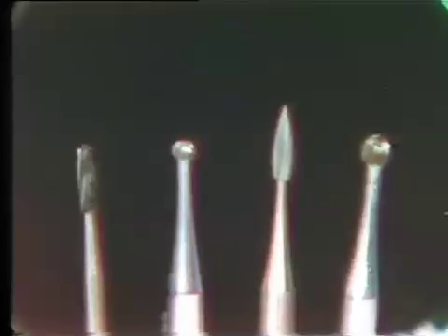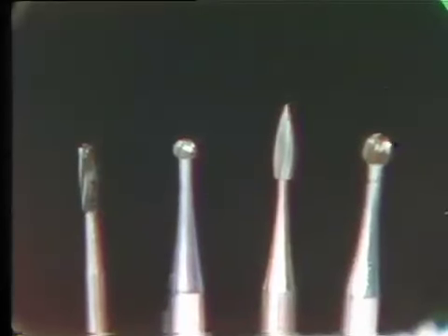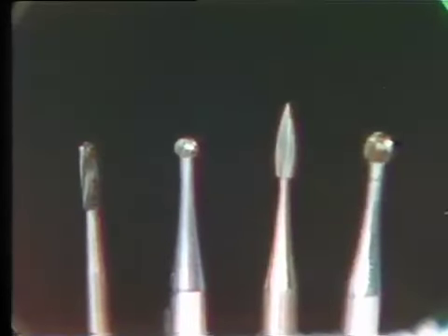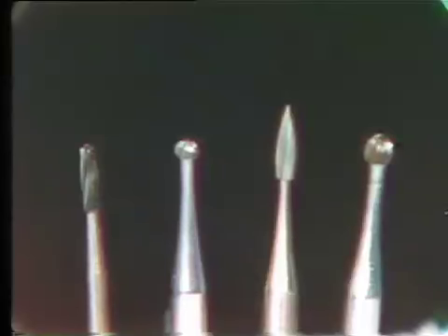The next burr is the number 4 round burr. With this burr, we go directly to the pulp and use this burr to unroof the pulp chamber in all anterior and bicuspid teeth. The next burr over is the surgical length flame-shaped burr. This is used to smooth and flare the endodontic cavity preparations for anterior and bicuspid teeth. As was mentioned in lecture, this burr is not issued to you. You have to make this burr from the straight handpiece burr.